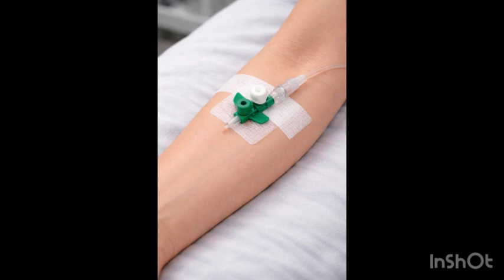Then there are some other places you can use. You can use the wrist, the dorsum of the foot, and also the saphenous vein. It is preferable to place the cannula in the non-dominant hand of the patient, because it will be much more comfortable for the patient.